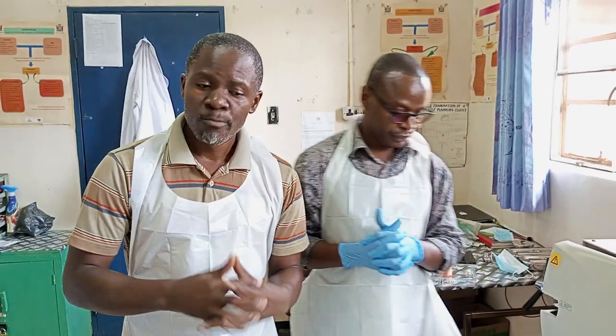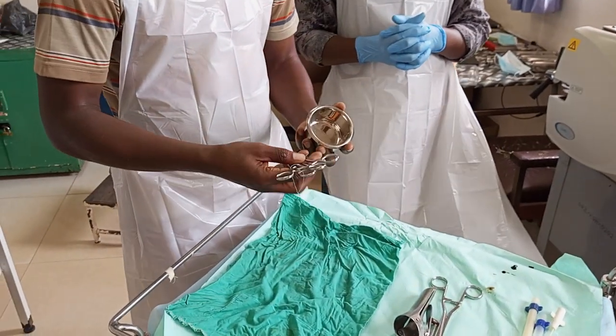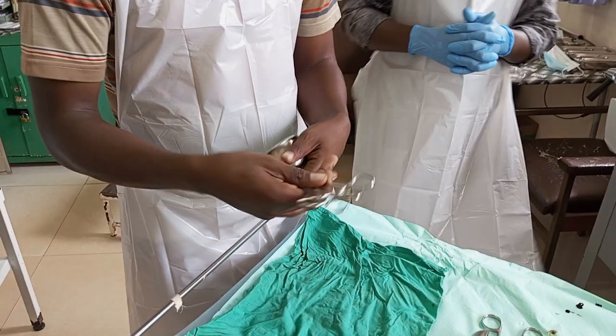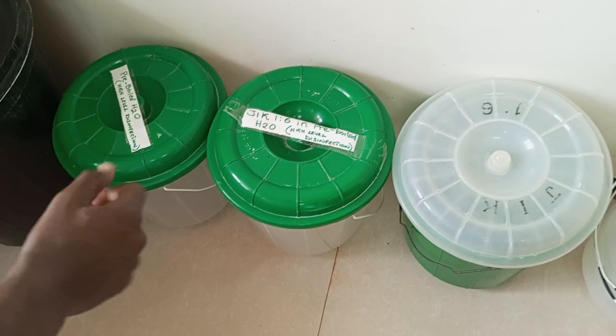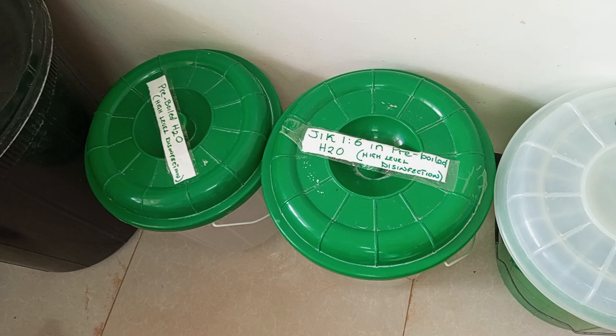Remember, initially we started with a decontamination process. Instruments such as these, like the gallipot, the forceps, were used on the patient. After you used them on the patient, we took them for decontamination, for which we used jik 1 in 6, which is just right here, behind you there. Then there's plain water, and there's also just soapy water.